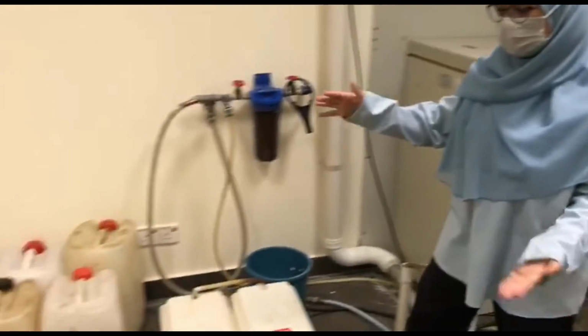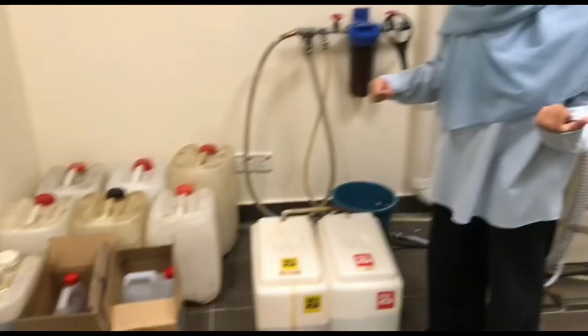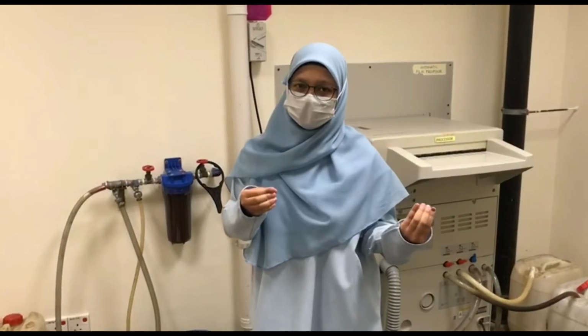so this is all the chemicals that are used in the darkroom processor. So X-ray image can be produced on the film.